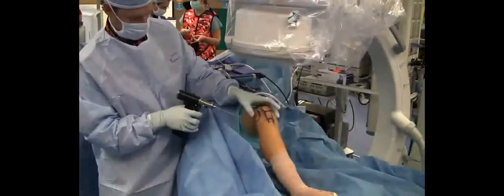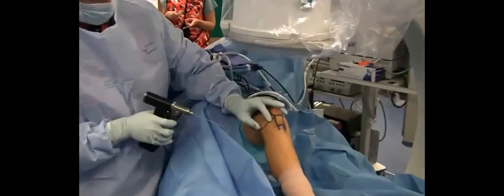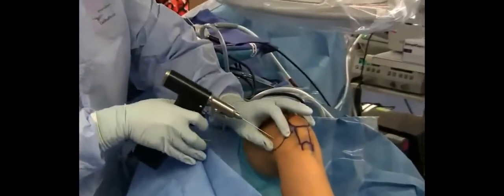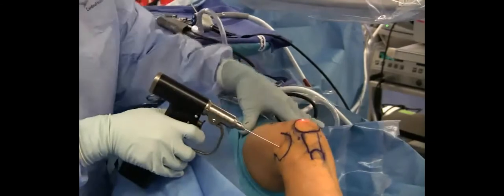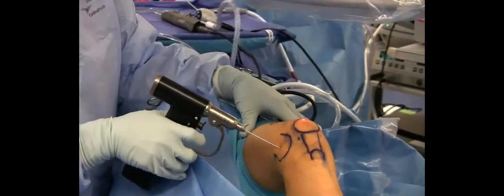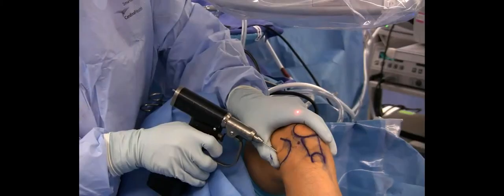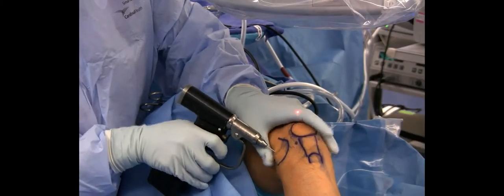After this has been confirmed, the fluid is expressed, the arthroscopic instruments are pulled from the joint, and we proceed with the extra-articular all-epiphyseal drilling. We mark out the physis as well as the lesion, and we advance our first 0.062 inch K wire to the center of the lesion.